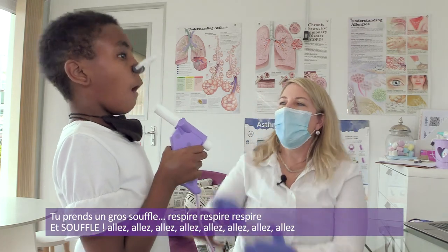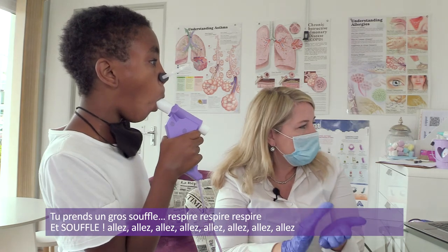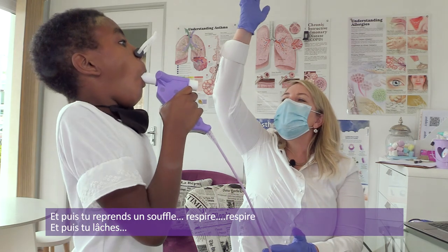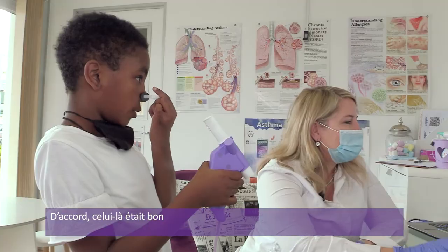Okay, it's that initial, yeah. Okay, we're doing the monkeys. All right, take a big breath in. Fast as you can. That's better. Go, go, go. And breathe in. And take it out your mouth. And then rest. Good. Well done.